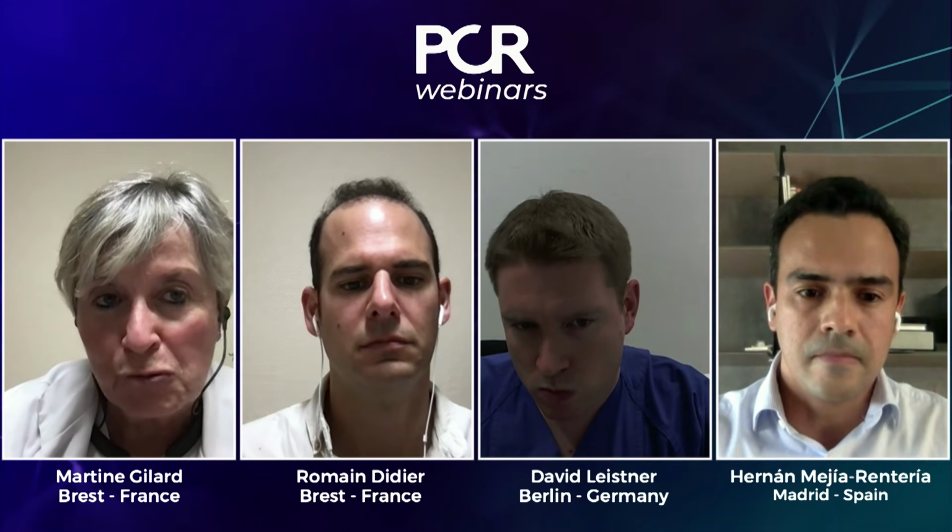Thank you very much. So for David, another question. You talked to us about the cutoff of the QFR. You said first 0.89, then 0.85. So the audience, because we have a lot of questions about it, wants to know what is the real cutoff for the QFR, and if there is a gray zone, what do you need to do if the measurement of the QFR is in the gray zone?